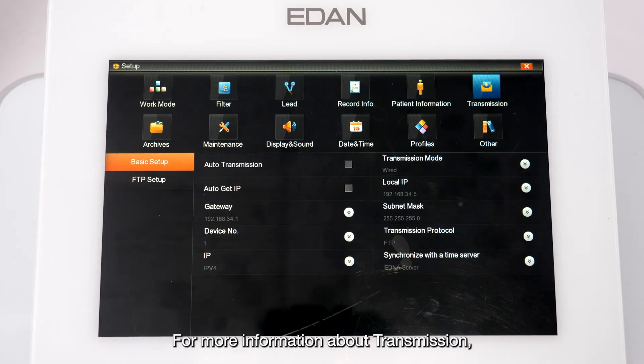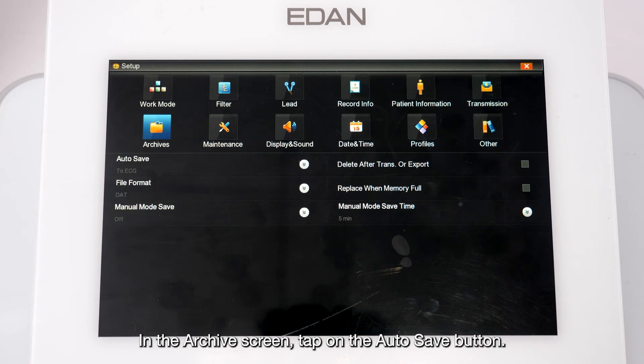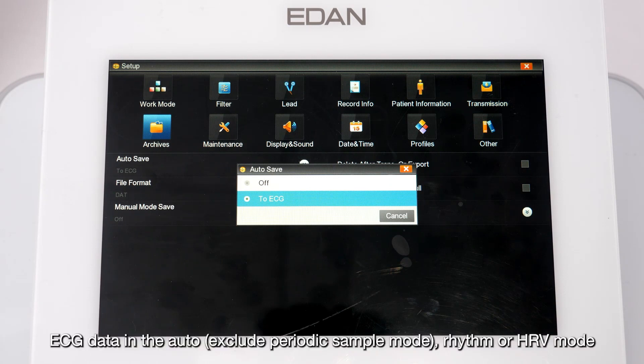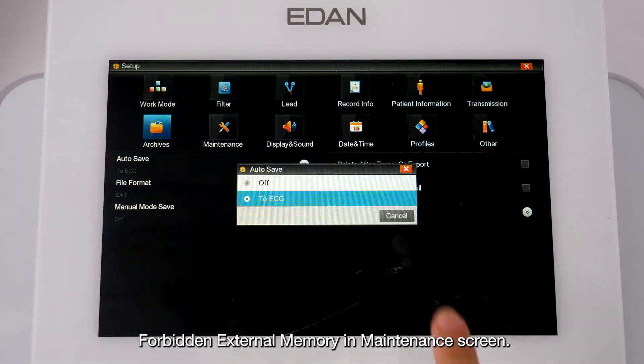For more information about transmission, please refer to the instruction to connect the SE-1202 with the SE-1515 for communication. In the Archives screen, tap Auto-Save and select to ECG or external memory. ECG data in auto (excluding periodic sample), rhythm, or HRV mode will be saved automatically, while ECG data in pharma study mode or manual mode can be saved manually. Note that external memory can only be used when the forbidden external memory option is disabled in the maintenance screen.